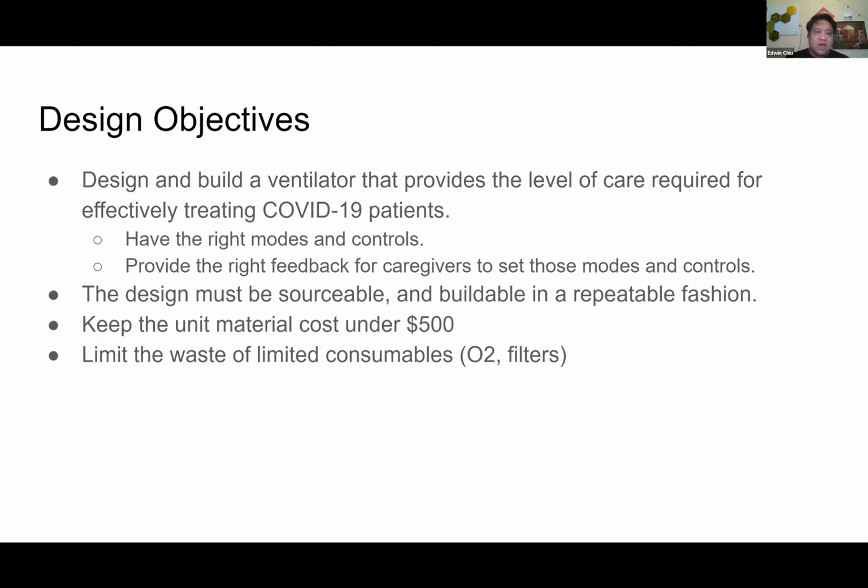The other objective is that the design has to be sourceable, and it has to be buildable in a repeatable fashion. We're also trying to keep the unit material cost under 500 or some number around there, to make something more buildable and more affordable for the countries that we're trying to serve. Finally, another design objective is to limit the waste of consumables, which are limited supply items, like HEPA filters and the hospital's O2 supply.